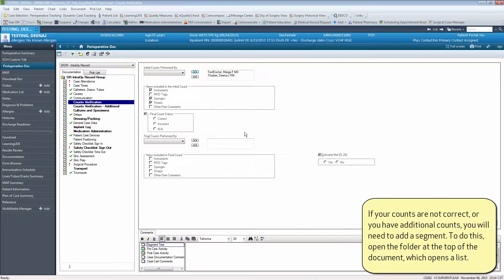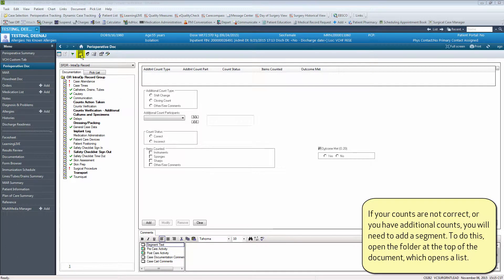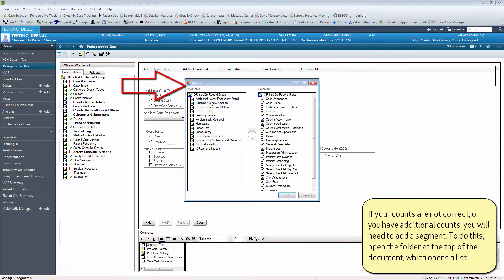If your counts are not correct or you have additional counts, you will need to add a segment. To do this, open the folder at the top of the document, which opens a list.